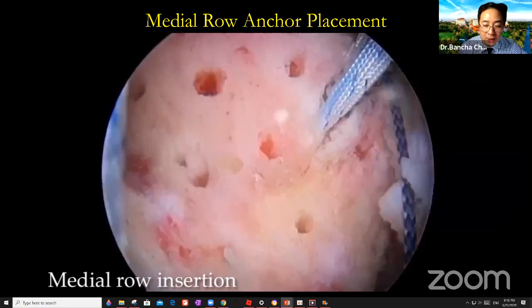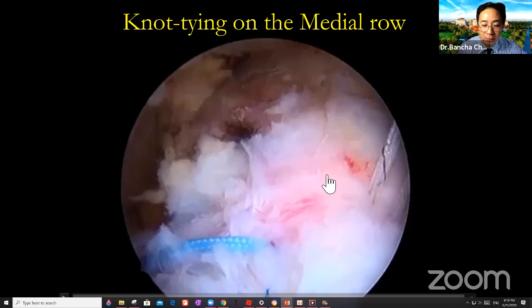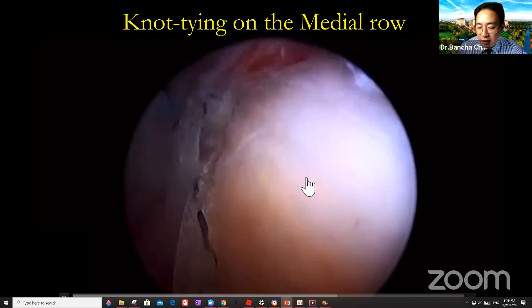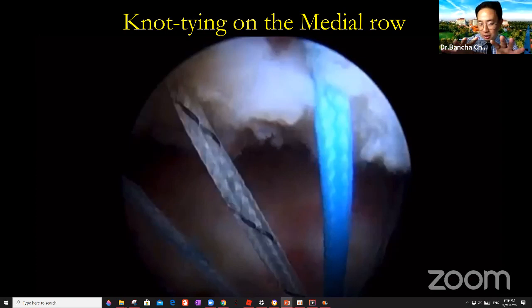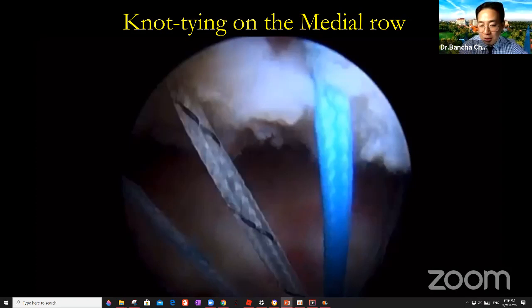And then we do knot tying on the medial row. I think it's important to tie the knot because many years ago I tried knotless, but I found that the reduction was not nice. Knot tying is important because you need to block the bone to the footprint, and this suture bridge will put the bone to the footprint. If you don't tie the knot, the post-op x-ray will be ugly. So we recommend you tie the knot on the medial row. I put fewer holes than sutures: one hole, two sutures. So we will have less suture on the cuff.